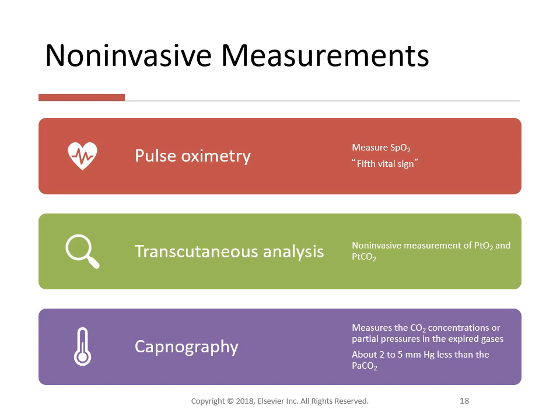Transcutaneous analysis. A typical transcutaneous sensor includes an O2 and CO2 electrode and a heating element. The heating element warms the underlying skin to 40 degrees Celsius to 42 degrees Celsius, which increases blood flow and thus arterializes the area. Warming also increases skin permeability and enhances diffusion of oxygen and carbon dioxide from the capillaries through the skin into the electrolyte gel under the sensor. These electrodes measure the gas pressures in the gel using the same electrochemical principles used in blood gas analyzers.